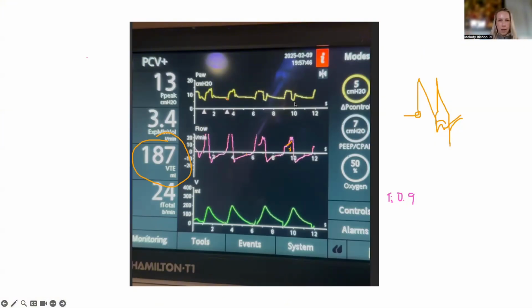So that's kind of how I like to explain it. Sometimes when I'm at the bedside and I'm asking the nurses to potentially drop sedation and they're a little bit confused, I'll literally throw them into pressure support and say, look, your patient is snowed, so snowed that they're not even breathing. No, they're deep enough, and this is why we're having the problem. Sometimes that's enough for them to be like, oh, I get it. We want them to at least have that triggering and that breathing.